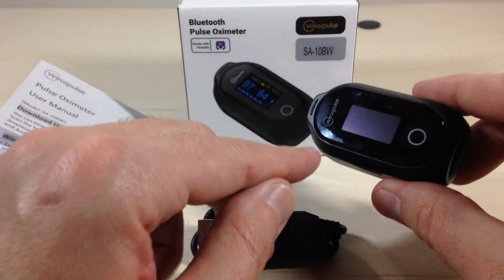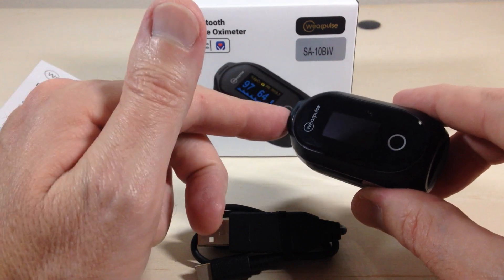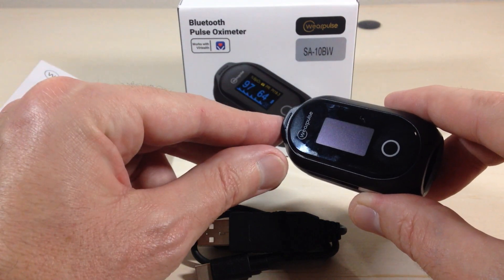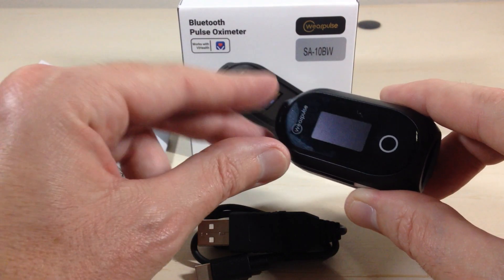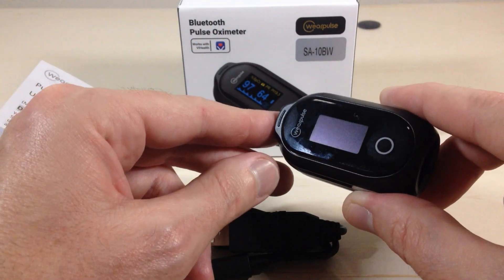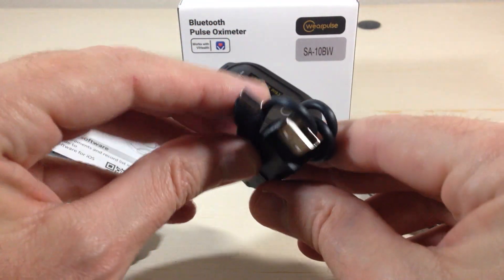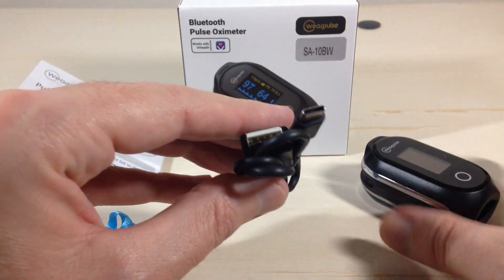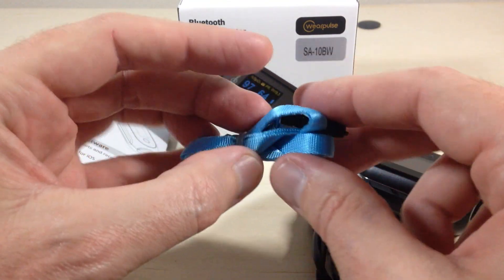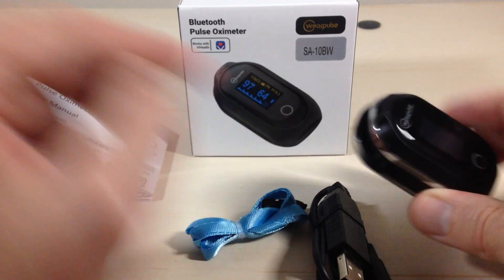So let's take a look at everything we get. You've got your pulse oximeter — it's rechargeable with a 24-hour battery life and it takes about three hours to charge. It has a multi-color OLED display, which we'll see in a second. When it's on and taking a reading, it records every second and has a built-in 80-hour memory on the device itself. They give you a USB Type-C charging cable, and they also include a lanyard in case you want to wear it around your neck or wrist.